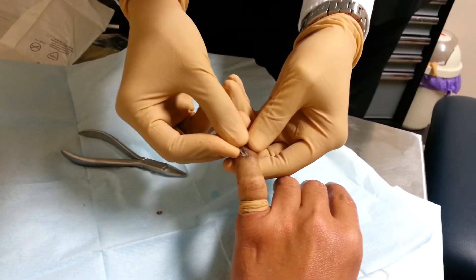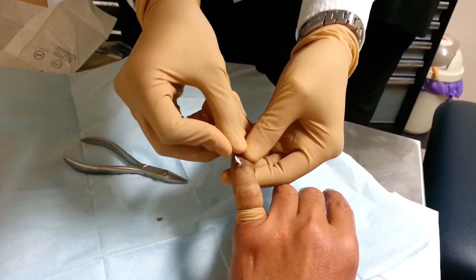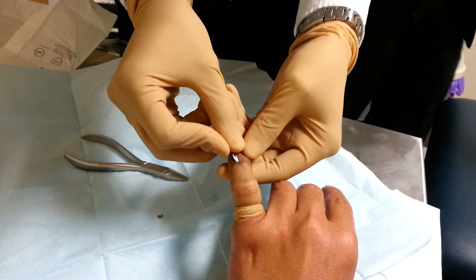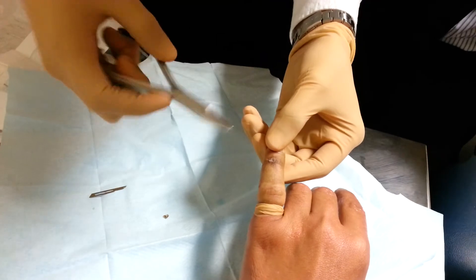There it is. I'm good, but not that good — no, that's why I'm like, no. Daniel, three big guy. There it is.